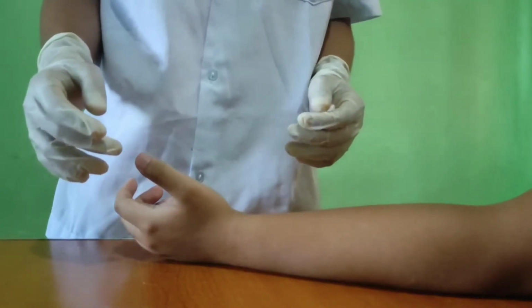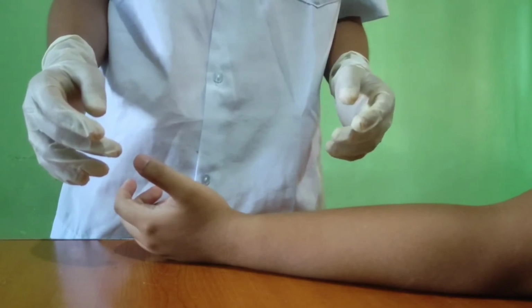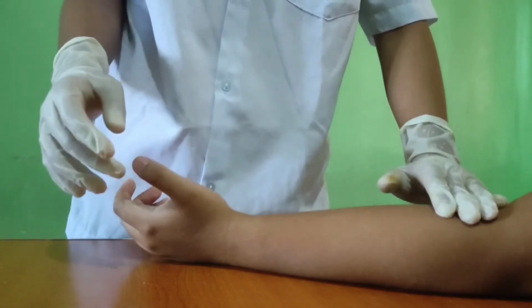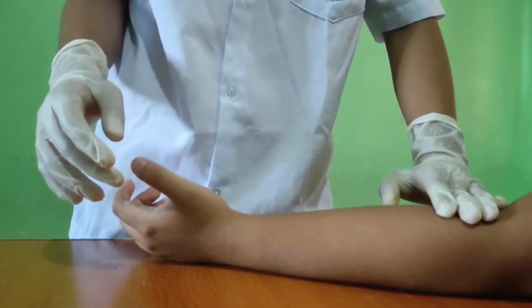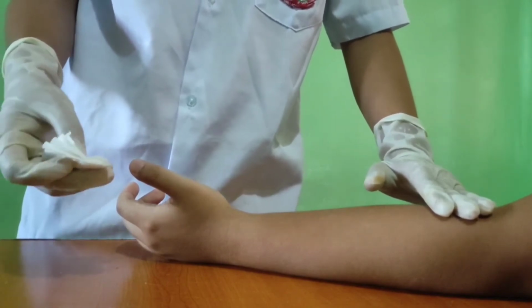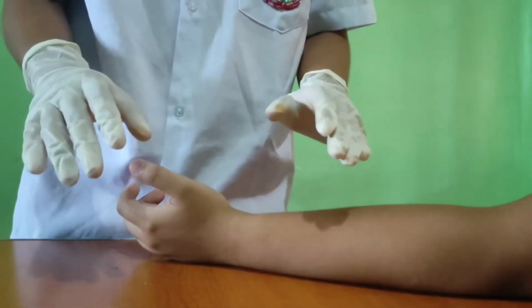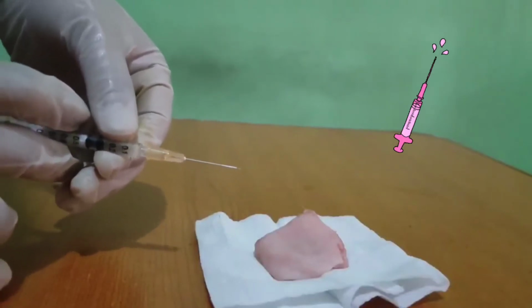On the patient's arm, find the injection site by using 4 fingers on the forearm: 1, 2, 3, 4. Make sure that the arm of the patient is on the table, relaxed. Wipe it in one circular direction, then wait until it gets dry. Now, we're ready to inject the patient.